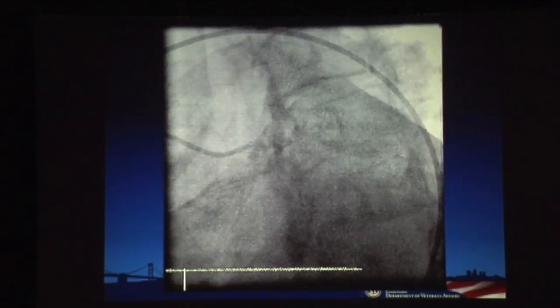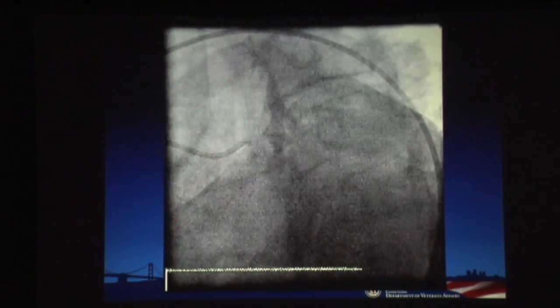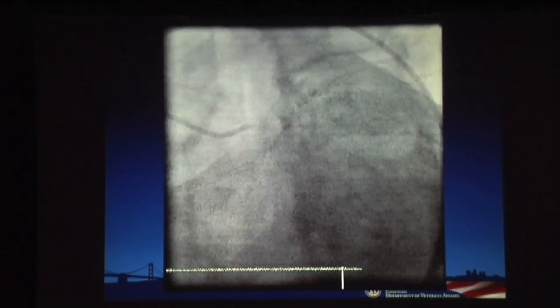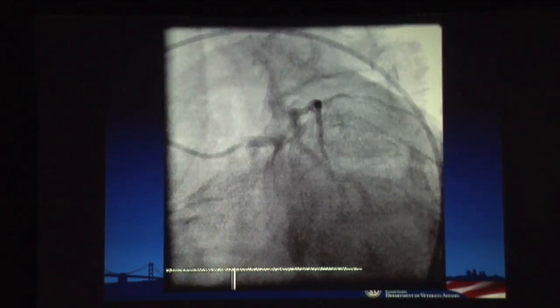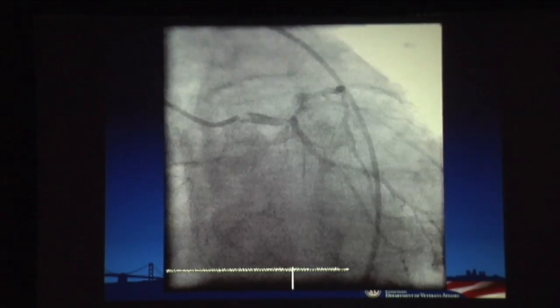This was a colleague of mine who did this cath, and you see that there's a long left main. There's some tapering at the distal left main. There's some lumpy, bumpy stuff in the LAD and the circ, but it's a little bit hard to see. In some other views, you start to get a sense there might be, again, some tapering at the distal left main. You start to see there might be a collateral branch going over from an atrial there. You notice the vessels are quivering like atrial fibrillation, and you see moderate disease here and there, mild to moderate.